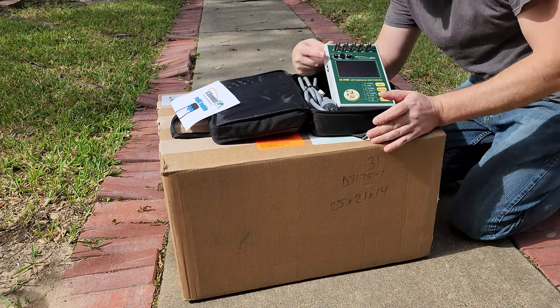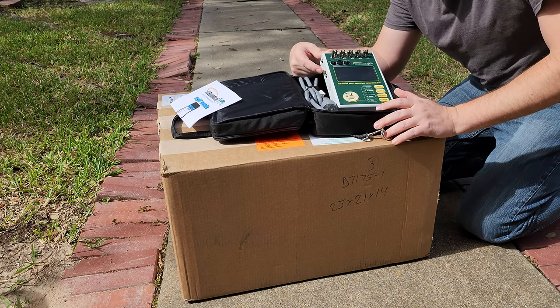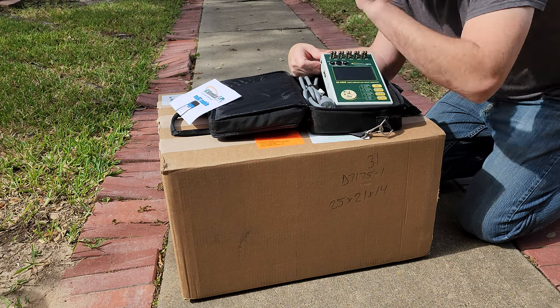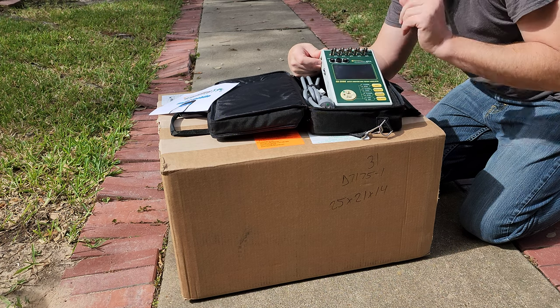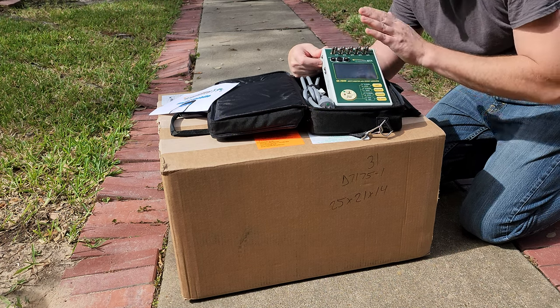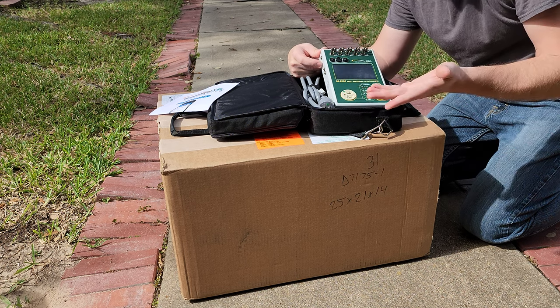I'm gonna do a couple of different videos on this — I'll go over its functionality, and then I'm gonna surprise one of my junior level biomeds. I'm gonna give them this unit and tell them to go do it. This is an automated electrical safety analyzer with a manual mode as well, but is it intuitive enough where a junior level biomed can take it and immediately deploy it and start using it?